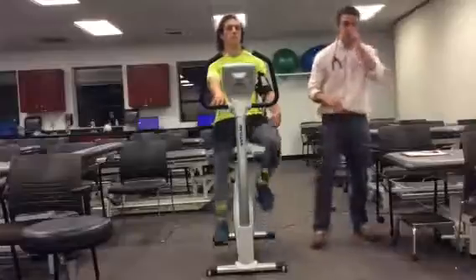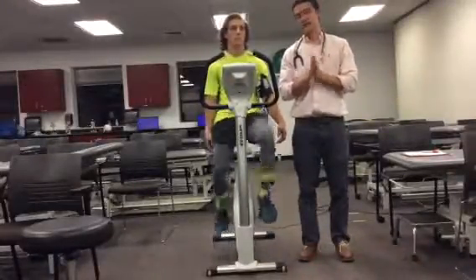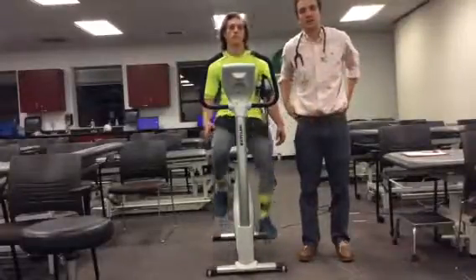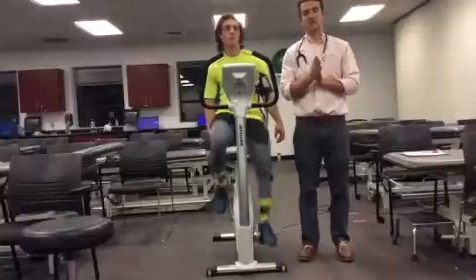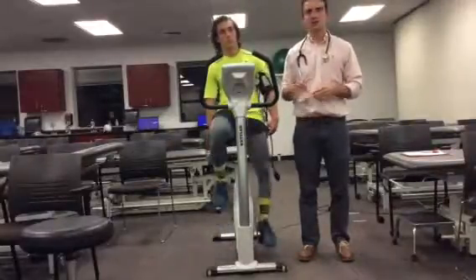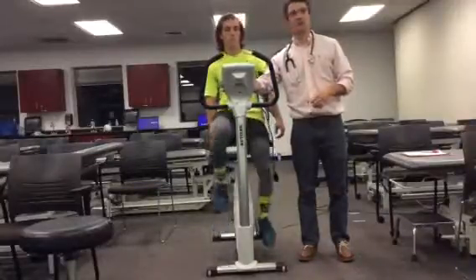Okay, so now I am going to bump up the workload to the actual test workload, and I calculated his workload to be 150 watts, based on his exercise history and the fact that he's in good overall health condition. So I'll go ahead and bump that up now and start the 6 minutes.